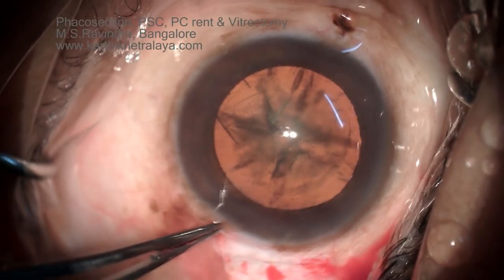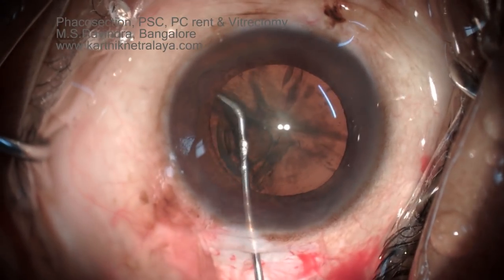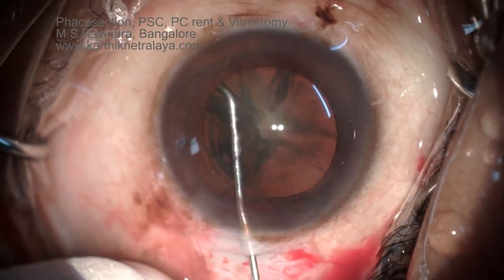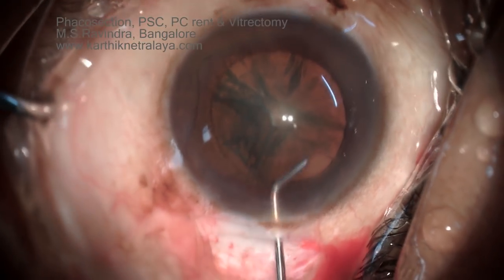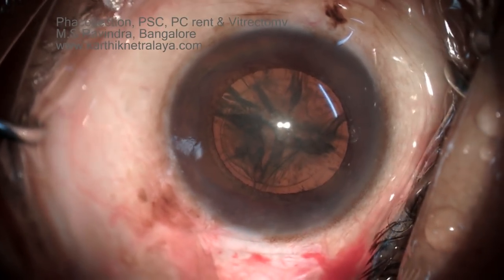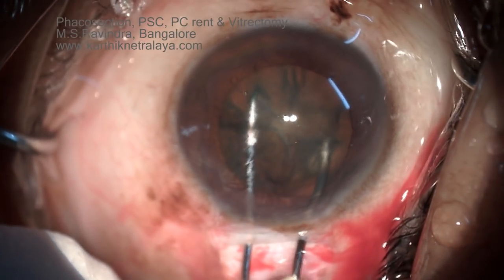Note that as the hydrodissection is being made there is some resistance to fluid flow. Usually one-point hydrodissection is adequate. It was done at three points, and the fluid was seen coming up halfway across the posterior capsule but did not proceed. It was stopped and then done from the other side, where it came up beautifully.